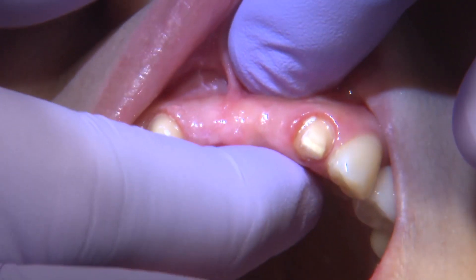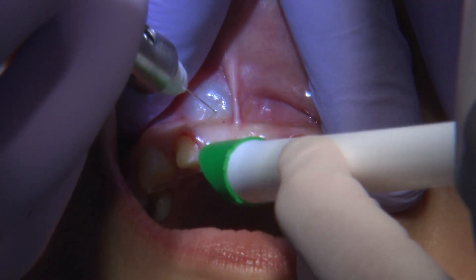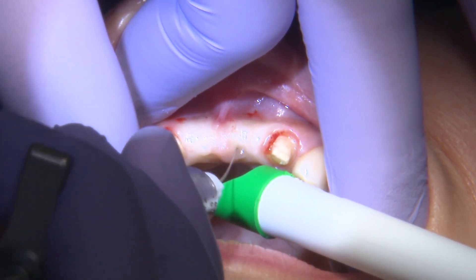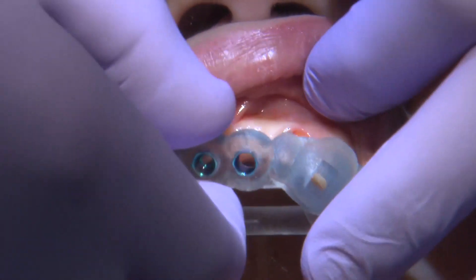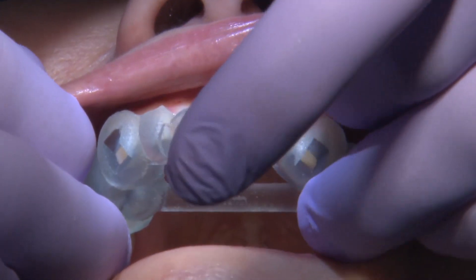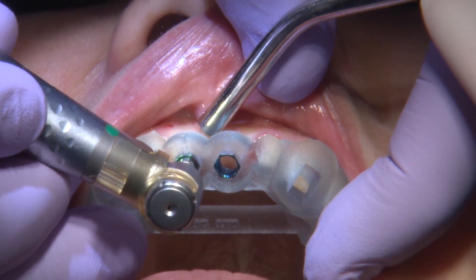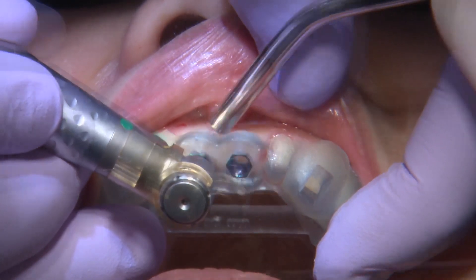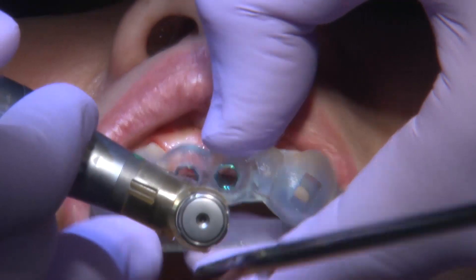Going through with treatment planning, at the next visit I also treatment planned to place implants in the proper position so that the patient can receive these implants and eventually have screw-retained crowns placed. Another request from the patient was that she wanted individual teeth so that she can floss between them like she did with her original teeth.